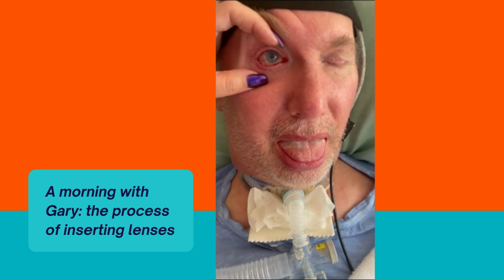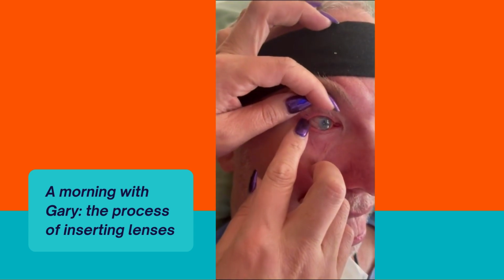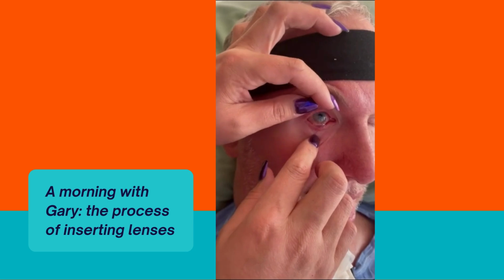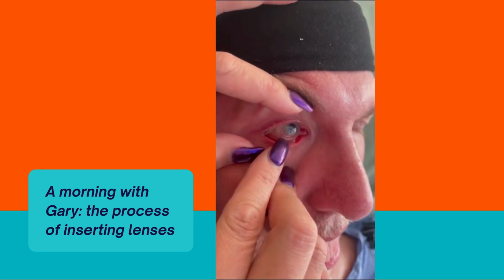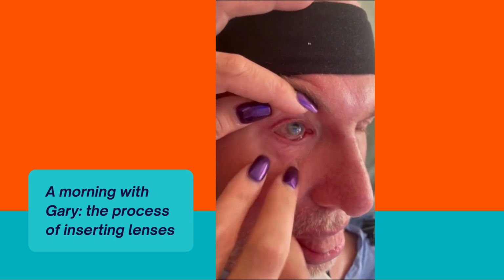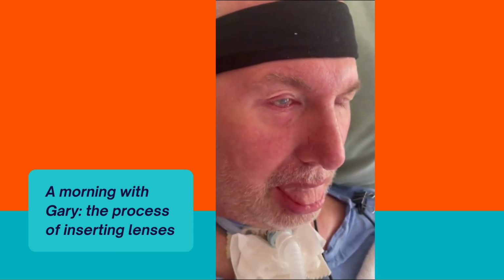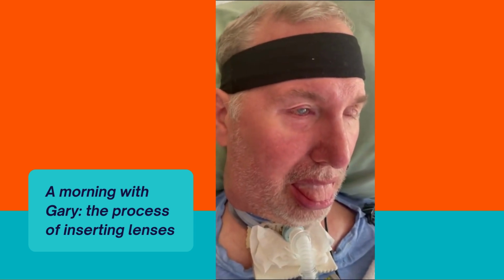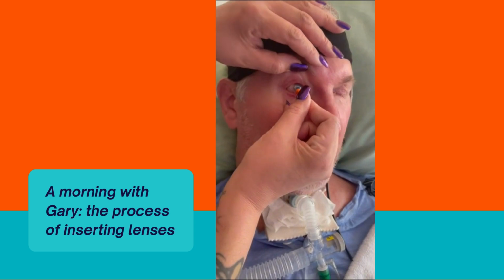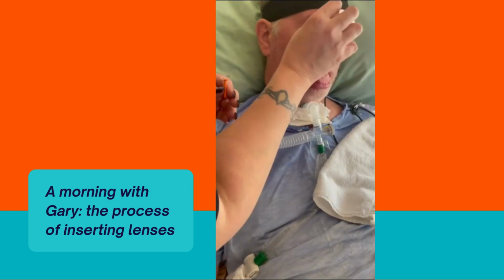And we made a boo-boo. There's a big bubble in there too. Okay, hold on. Let me push it so they can see what the bubble looks like. So here you see this circle here. That's our bubble area. Because it has the bubble in there, it's going to be basically blurry for Gary. He'll say blurry, or bubble. And that's when we'll have to take it out and try again to make sure he gets a very clear view.